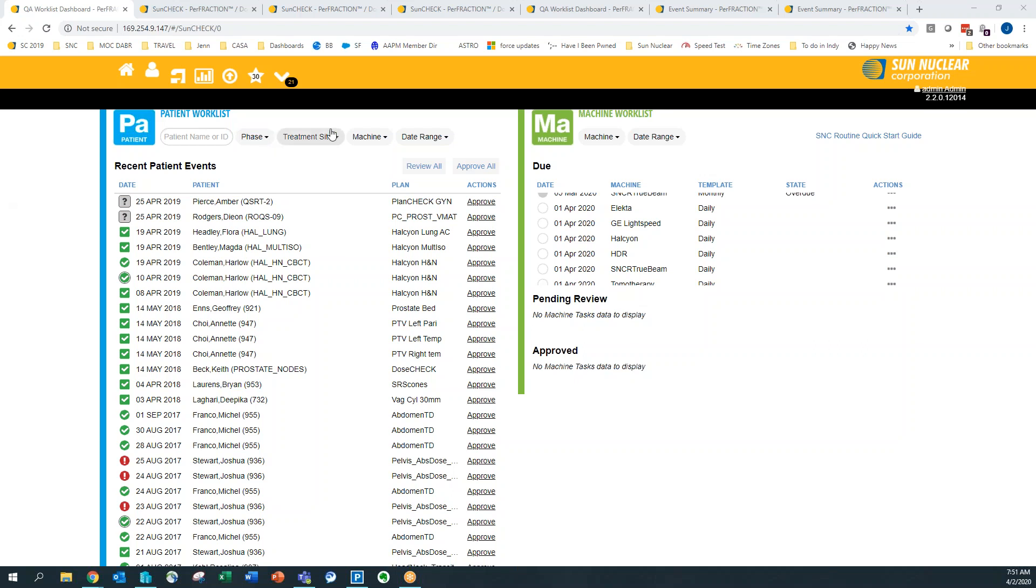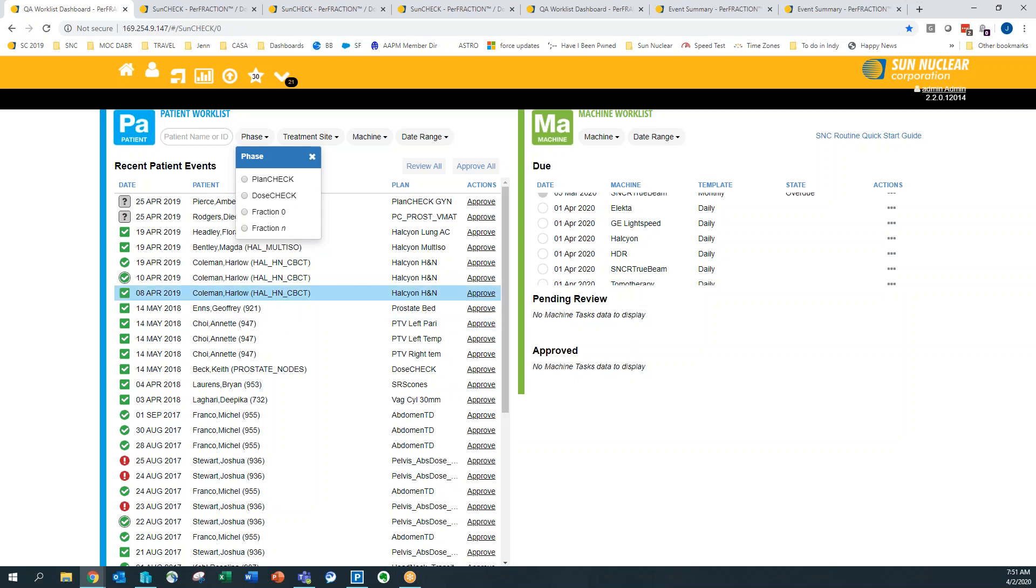So on the patient side, you can see that you can do plan checks, dose checks, so your secondary dose checks, pre-treatment QA, and in vivo QA, so you can track your patient throughout treatment.